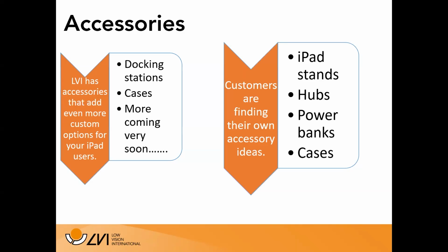One of them might be the docking station that has an XY table for somebody that does high volume reading. They may have that docking station back at an apartment or a dorm or at home, and then take the Magnilink S out of the docking station and take it to class or to work or to another meeting type environment. Another docking station might be one that clips to the desk that you can insert your Magnilink S into. Again, that's going to save footprint space and give you more clear desk space for whatever tasks you have.